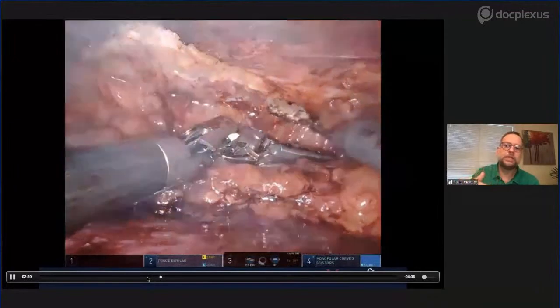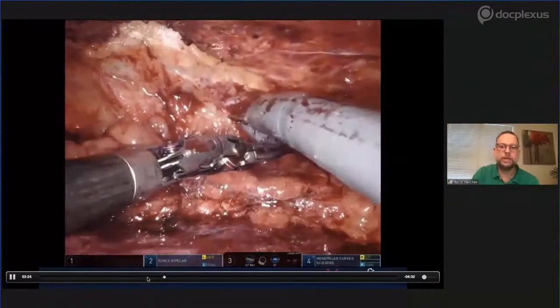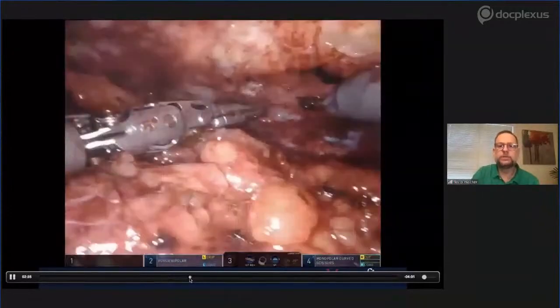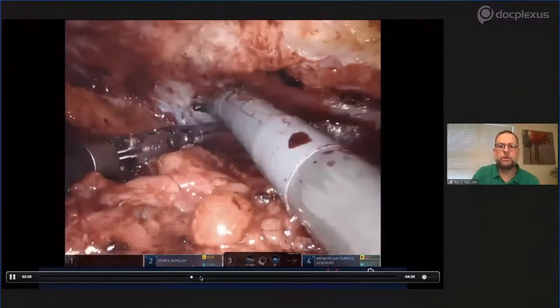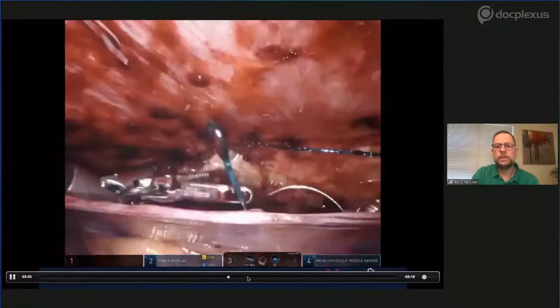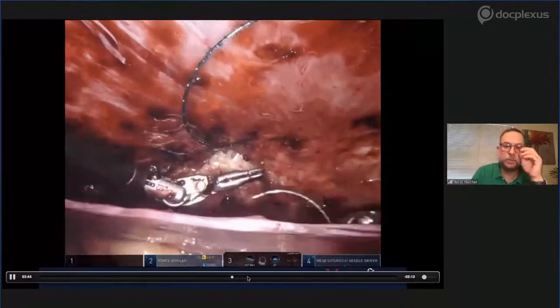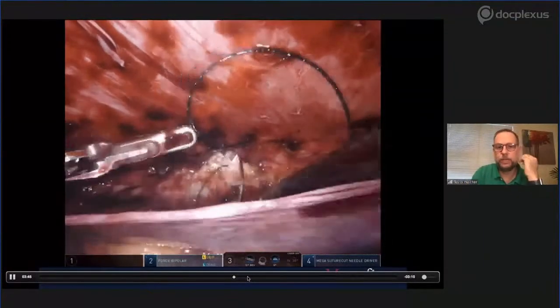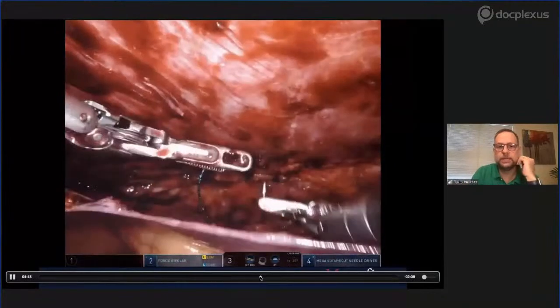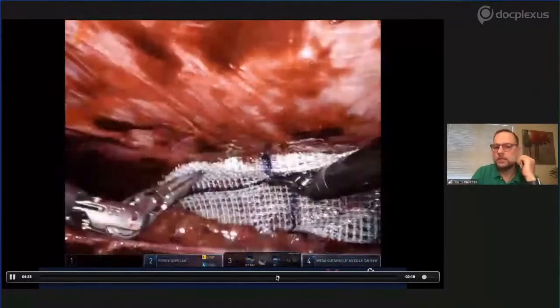Now it will start to get more difficult as I'm reaching the contralateral thin peritoneal area. But little by little, you create your space, pushing up the wall, buzzing, retract, buzz, push. Once you have enough space, close the defect. Even the tiny small ones, probably we don't need to close, but I have it as a routine to close all those defects. Once the defects are closed, for those small defects, I use ProGrip.